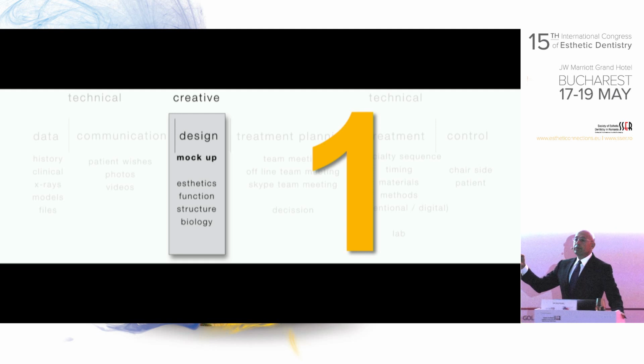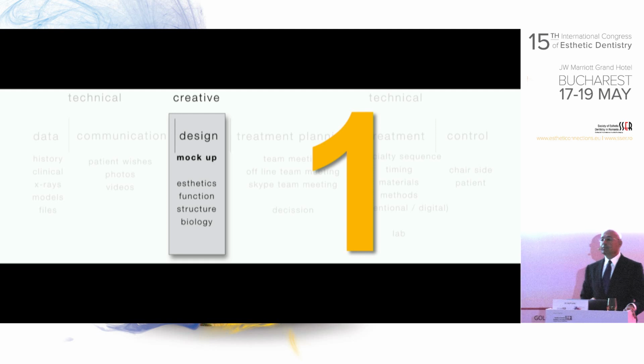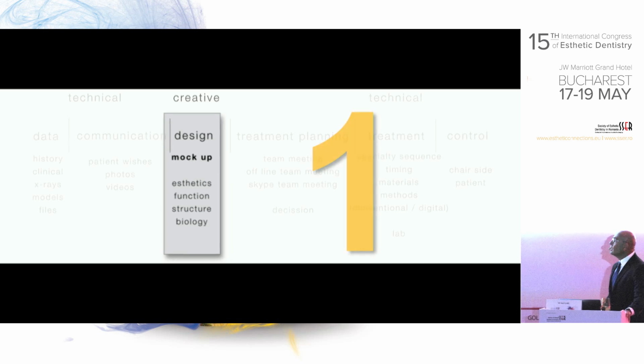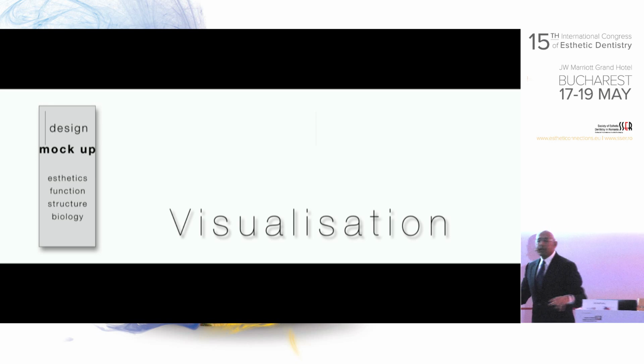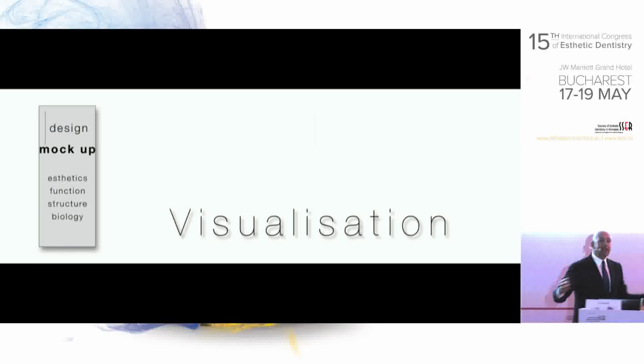So a mock-up in 3D is something you have to deliver to the patient, and this is a process of visualization. And what I see, unfortunately, not in Romania, not in Turkey, not in the States, is that very, very few dentists work with these steps.